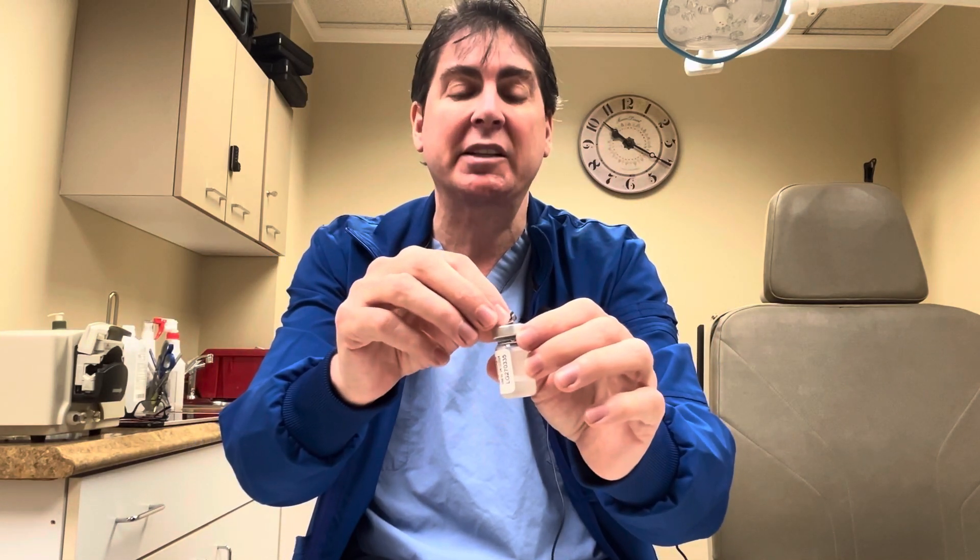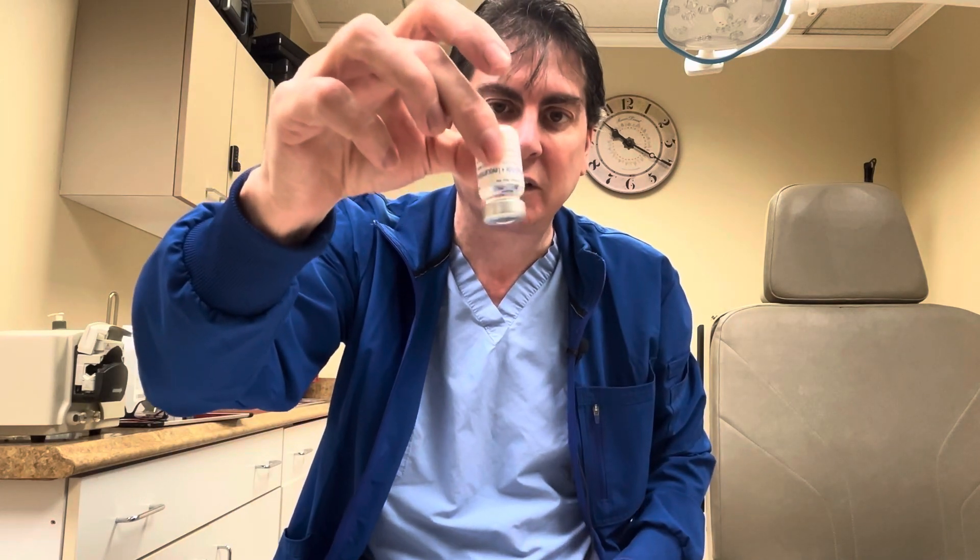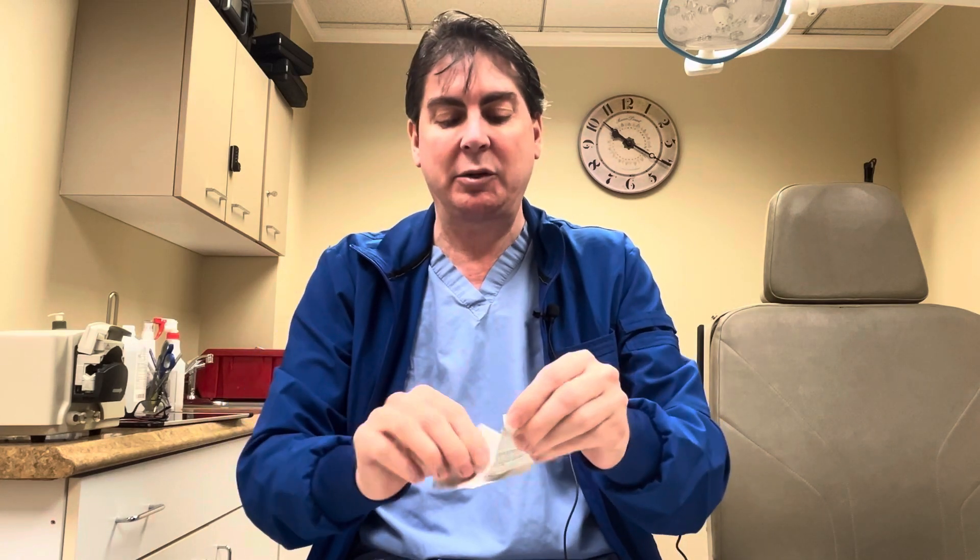Because it's a new vial you take the top off, and you'll only have to do that once. When you turn it upside down it's not going to fall out. The first step is to take your alcohol pad and clean the vial cap itself plus an area on your body.